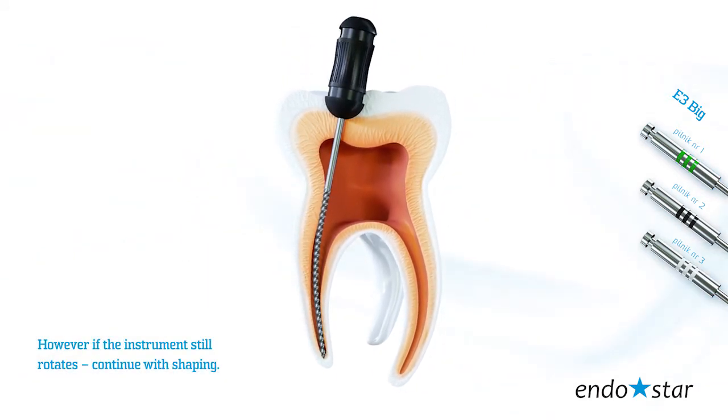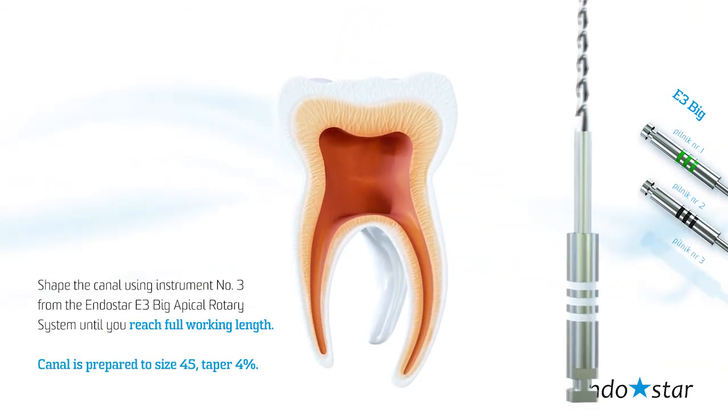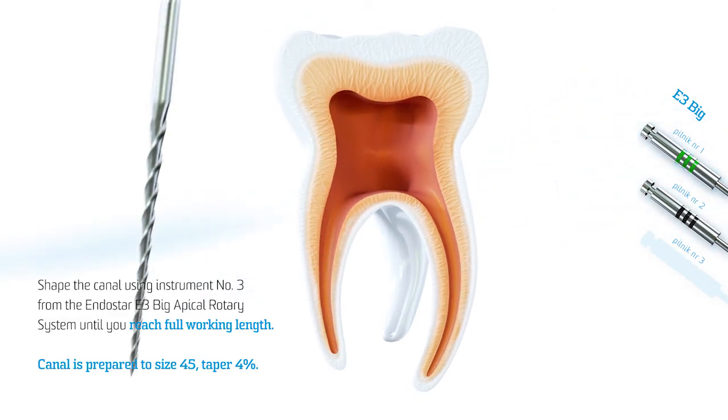If the instrument still rotates, continue with shaping. Shape the canal using instrument number 3 from the EndoStar E3 Big Apical Rotary System until you reach full working length. The canal is now prepared to size 45, taper 4.